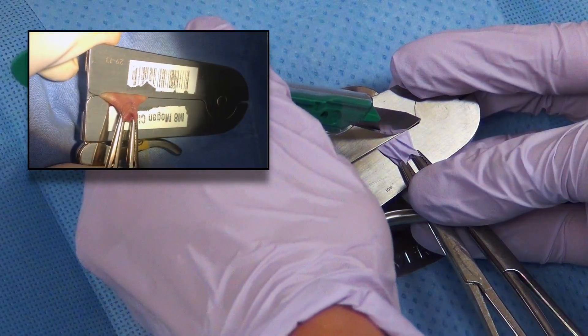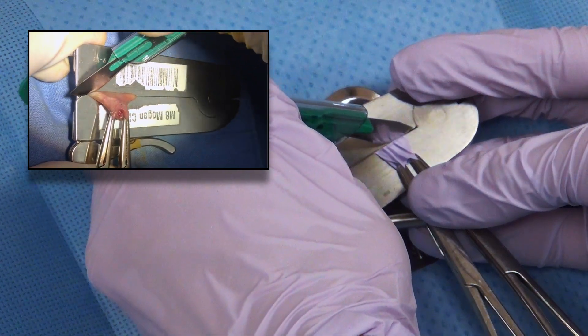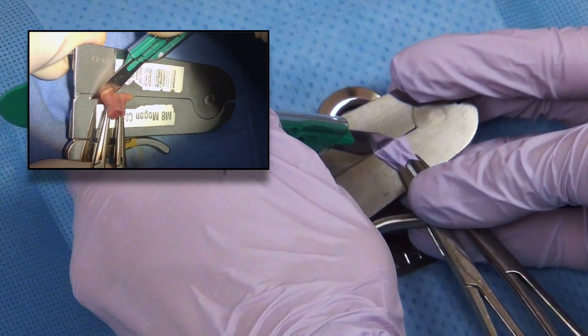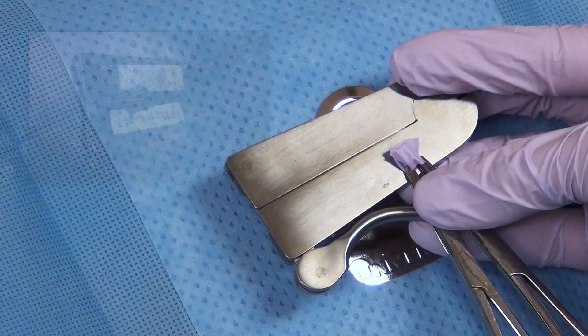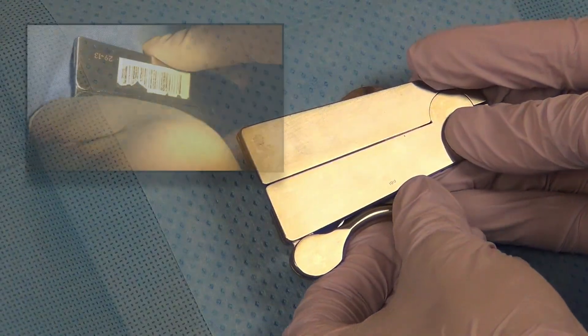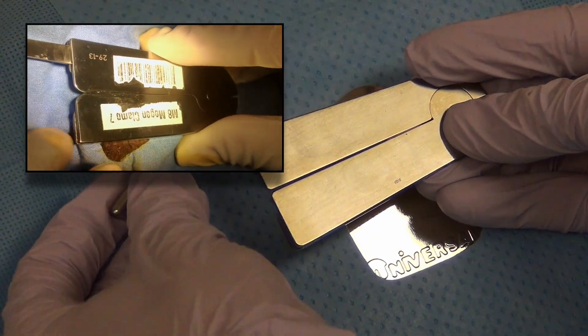The clamp is then closed and left in place for 3 to 5 minutes. A scalpel is then used to cut the foreskin flush with the clamp.